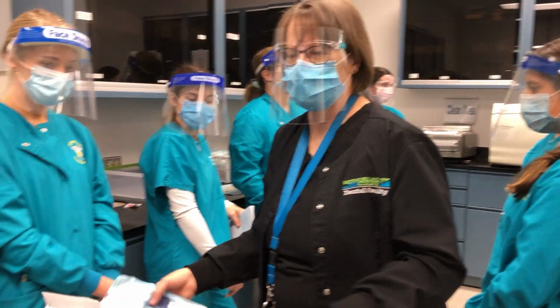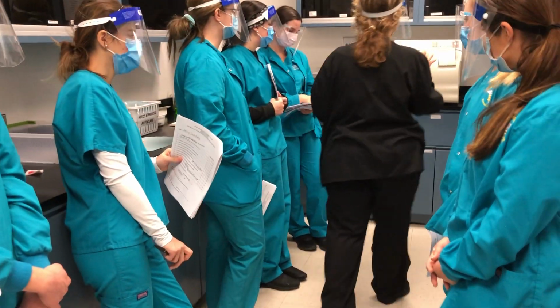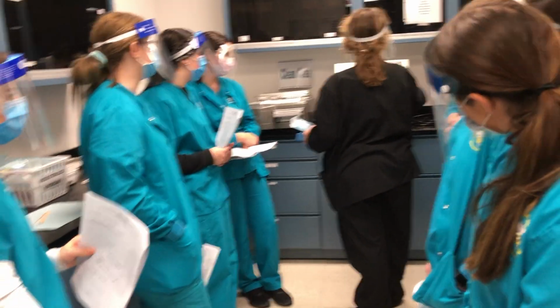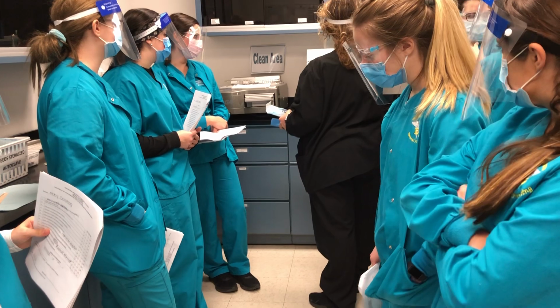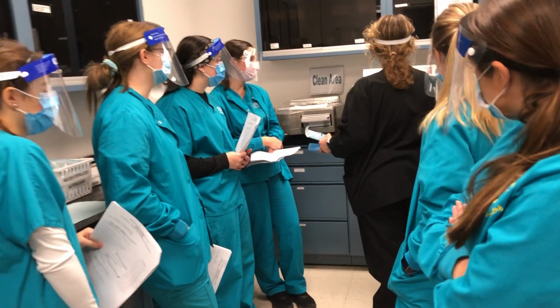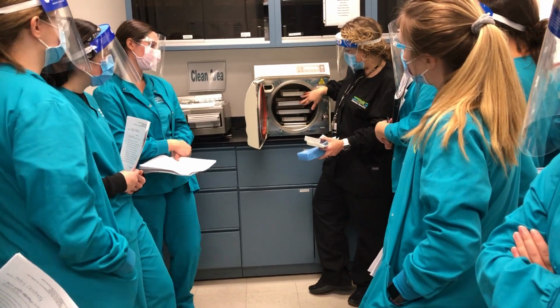Okay. So we'll switch places. I'm gonna come down to the autoclave. There's a few things that I want you ladies to recognize when we load an autoclave. The big thing is the door is like a chamber. So you just pull this open and back if it's locked, and you'll see this chamber here that you can pull out drawers, push them back in.